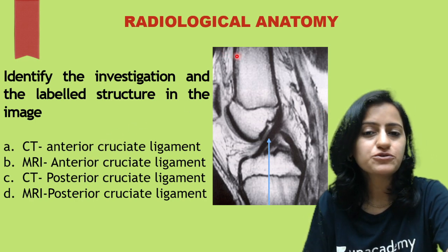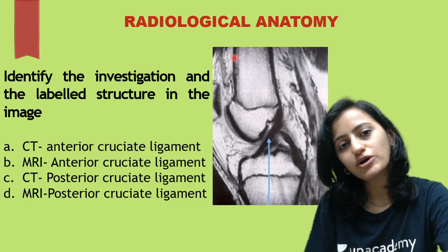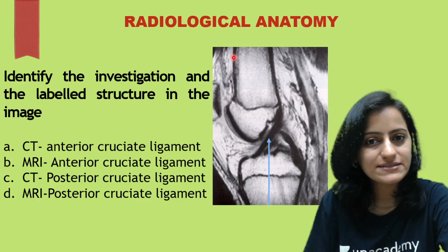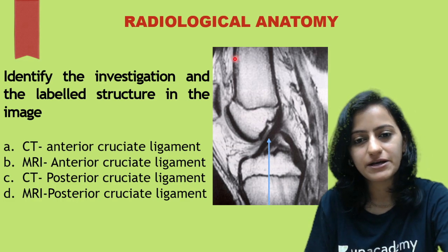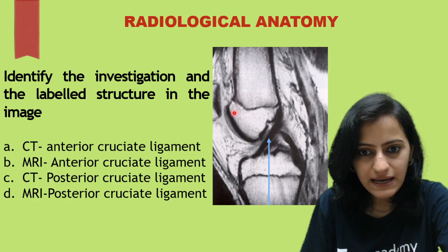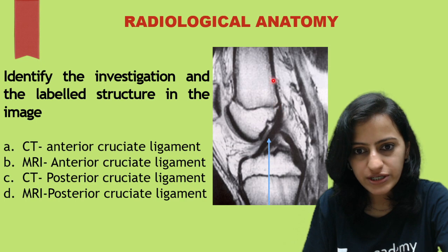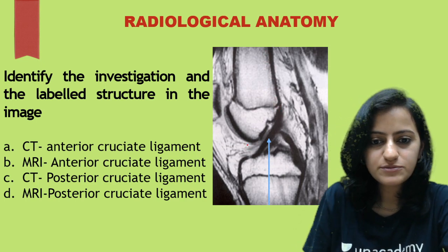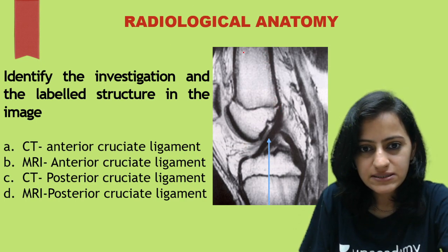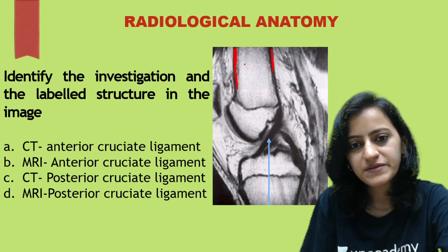The thing to look for is the bone cortex. If the bone cortex is white, it is a CT scan. If the bone cortex is black, it is MRI. What we see here as the black line is the bone cortex — so this is an MRI.